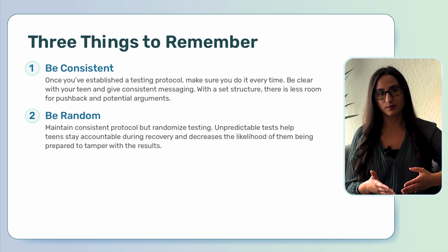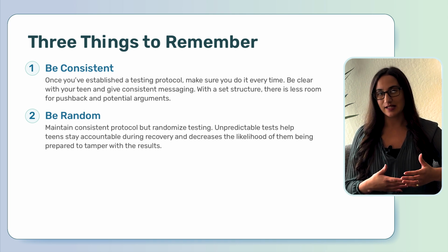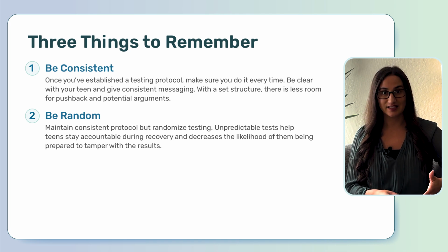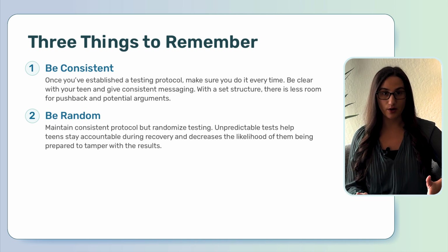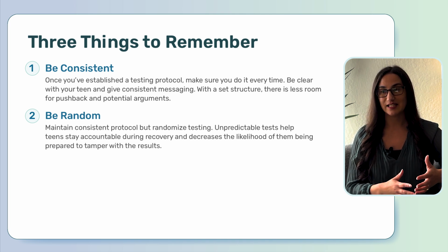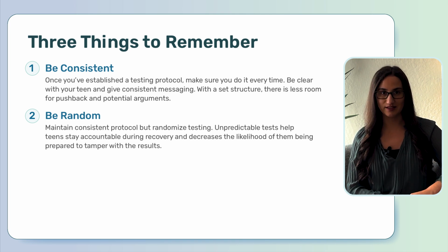And for parents, it can be really useful because when you keep things random, your teen is not going to be able to anticipate when they're going to be tested. So that means it lessens the chance for them to be able to easily tamper with the tests. Now, it of course does not make it impossible, but it does make it a little bit more difficult if they can't think ahead and plan and anticipate when they're going to be tested.